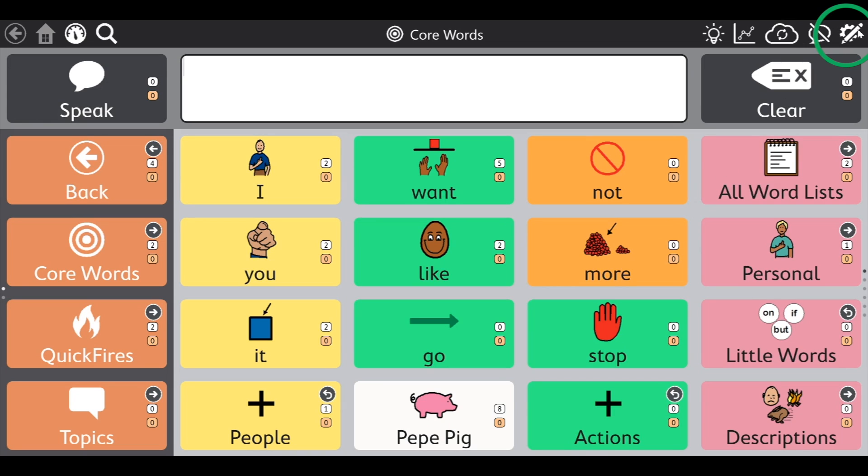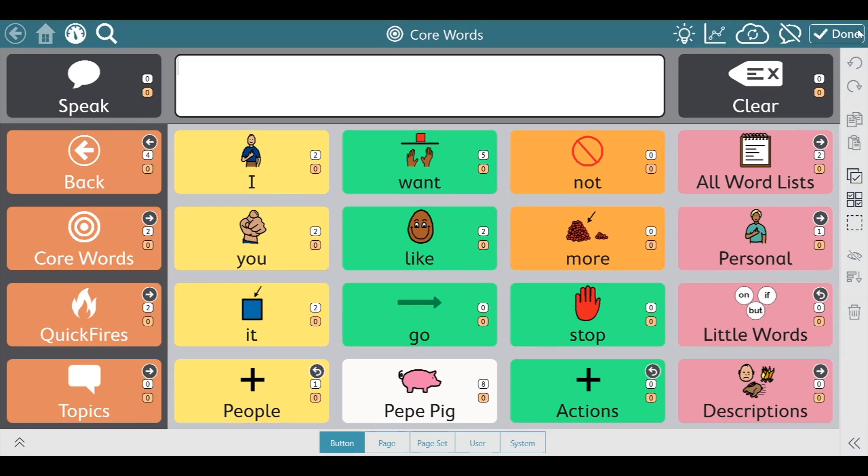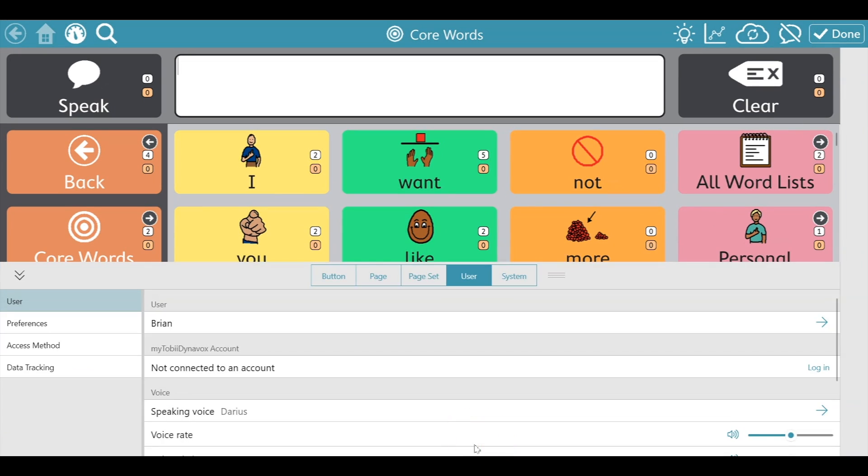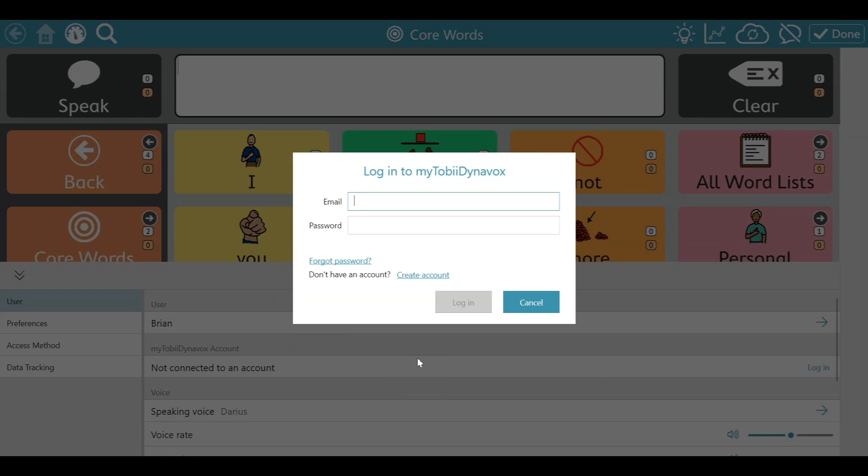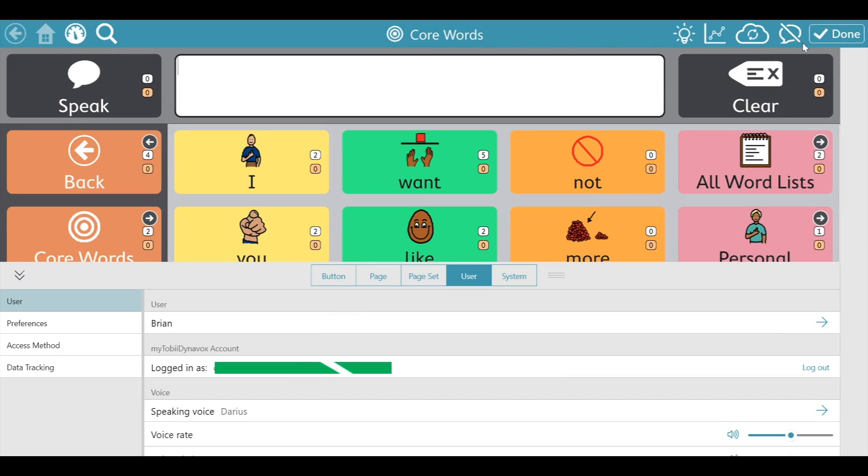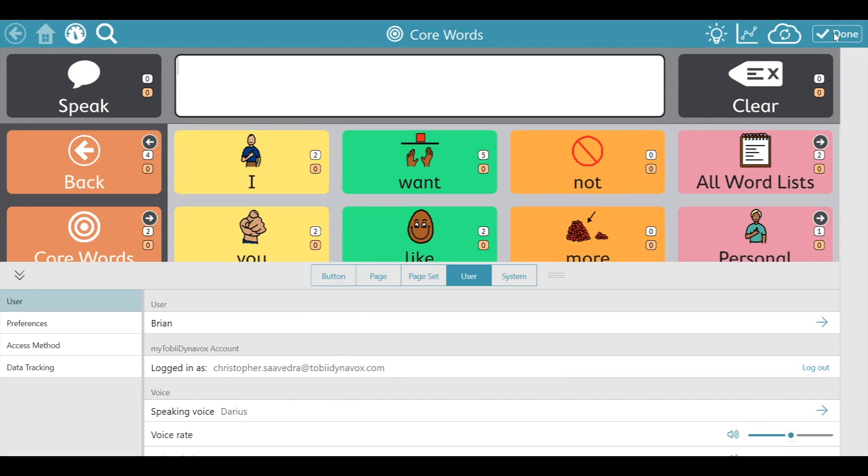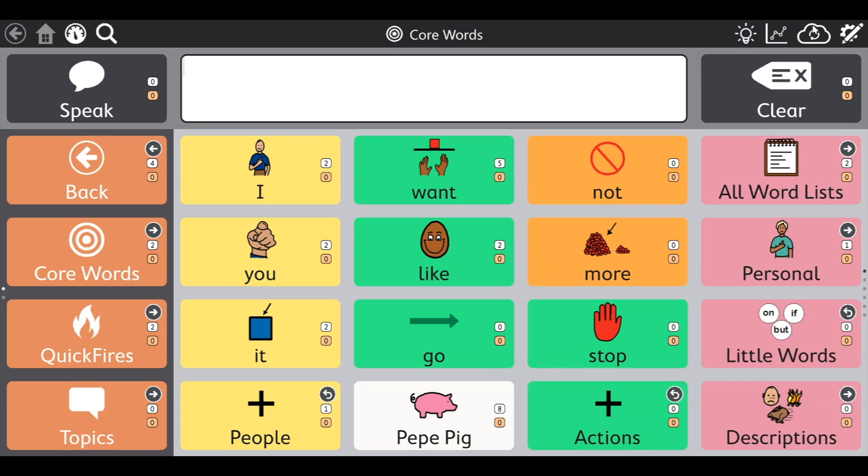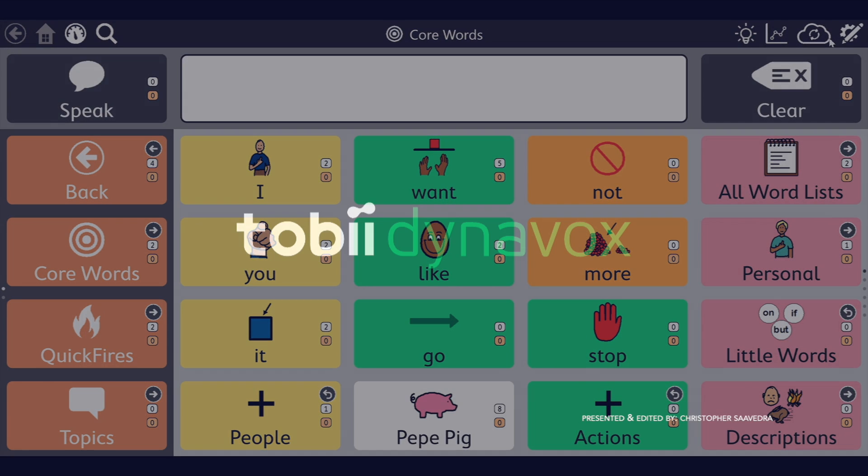Once it's reopened, let's log back in. Put in your credentials. And now you can see the bubble disappear. Congratulations. You've learned how to take away the bubble with the line through it.